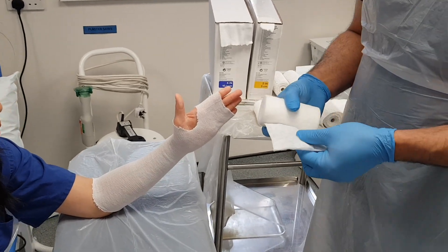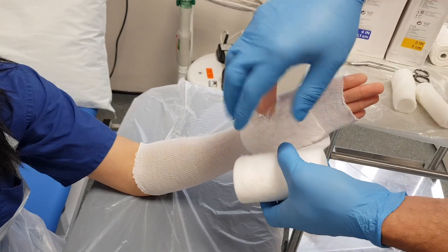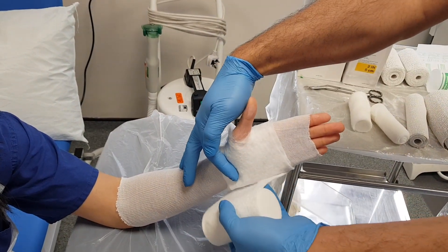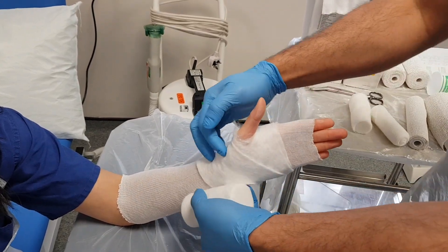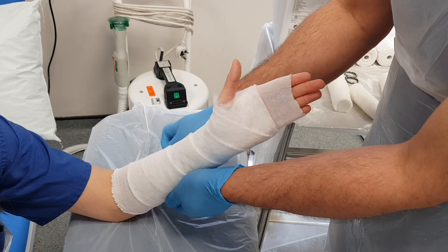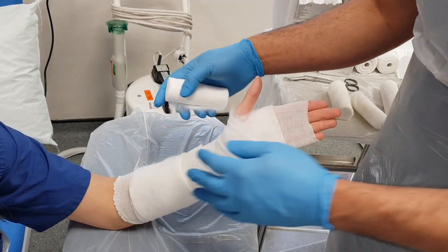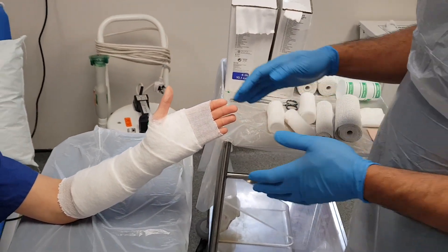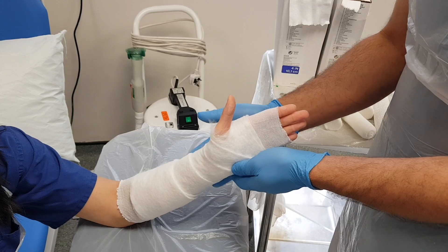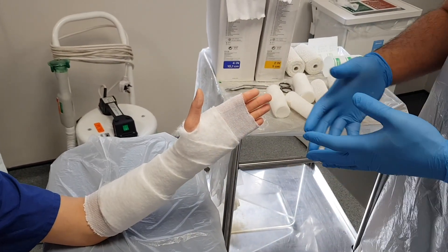Next we're going to apply some wool. I'm going to make a hole in it so I can secure it to the thumb. I'm going to wrap it around and make a hole, because I want at least two layers at every level. I'm going to go around the thumb and overlap it 50% every time I make a revolution. At the proximal end I need to make sure I've got two full layers, then cut it off and smooth it down. I want the plaster to cover the volar side, the radial side, and the dorsal side of the wrist, leaving the ulnar side free for expansion in case there's compartment syndrome.